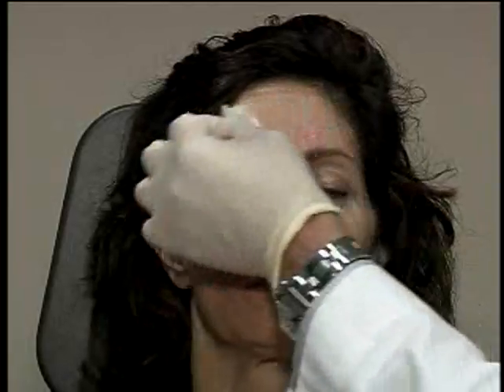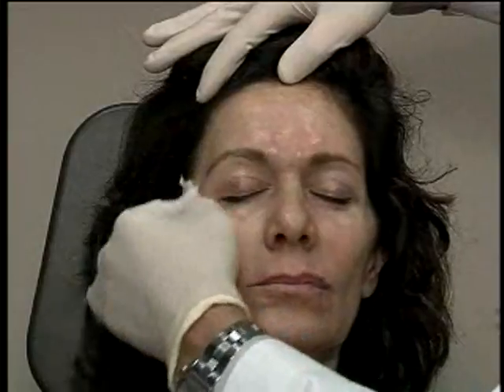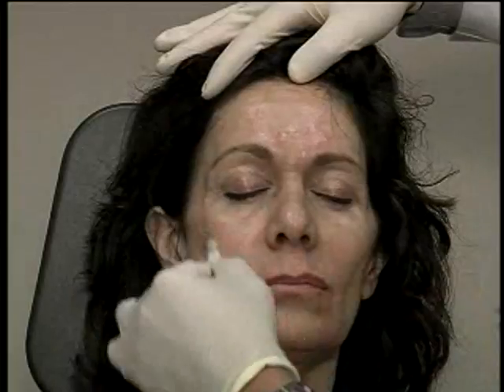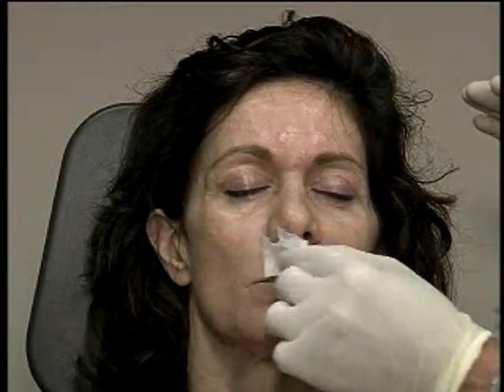So we make sure that she's cleaned off everywhere that we're going to treat her with fillers. So we clean off the whole area, and we use an alcohol pad. It's important that you do clean her off everywhere. You don't want to get an infection. I have seen an infection before with hyaluronics, which I treated effectively with antibiotics, but you don't want that to occur. So you want to make sure that you clean off all areas to be treated. Now she's been already prepared by my assistant, but I'm just kind of showing you using the alcohol to make sure all the areas are clean. We last over the lips where that doesn't smell or taste so good.